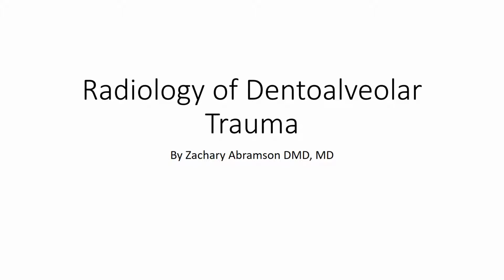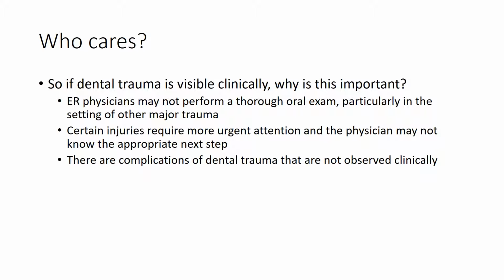This lecture is on the radiology of dentoalveolar trauma. So the first question you might be asking yourself is, who cares? Wouldn't dental trauma be obvious clinically? Well, yes, but this assumes the ER physician performs an intraoral exam, which they don't always do. And in the setting of trauma, the oral cavity may not be top priority.